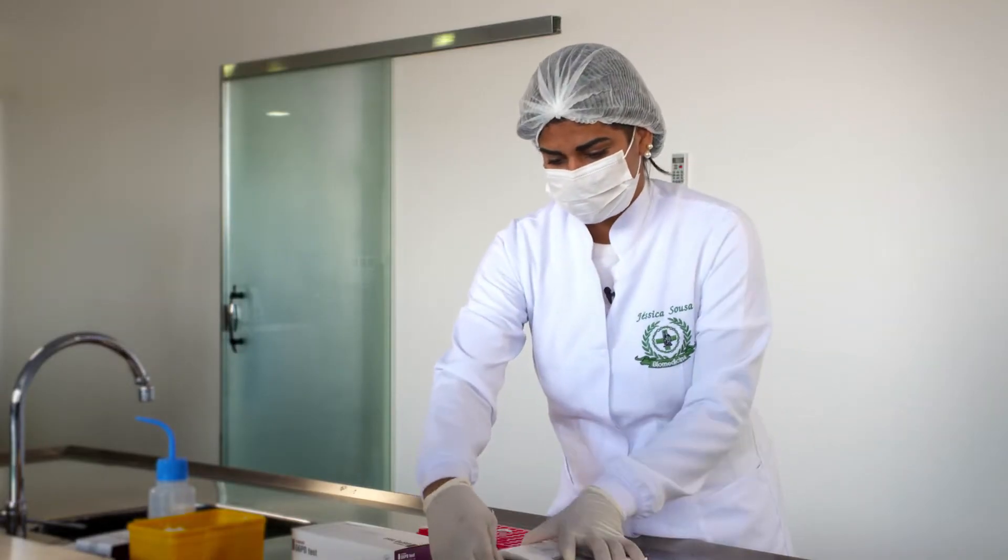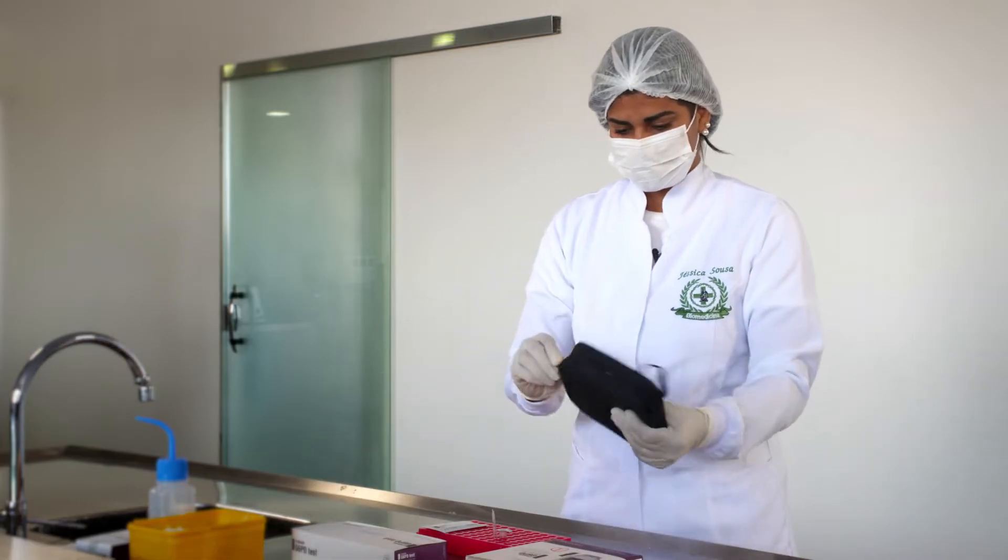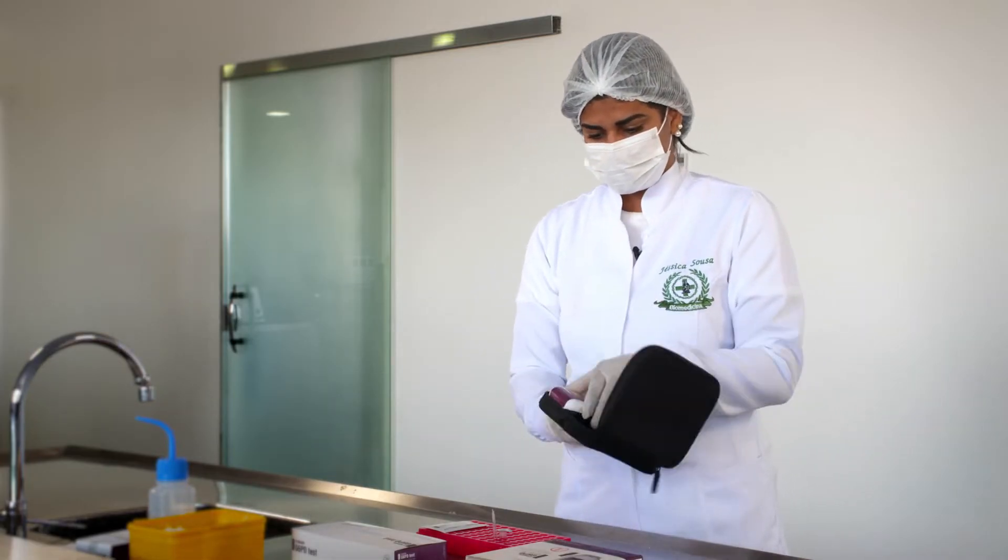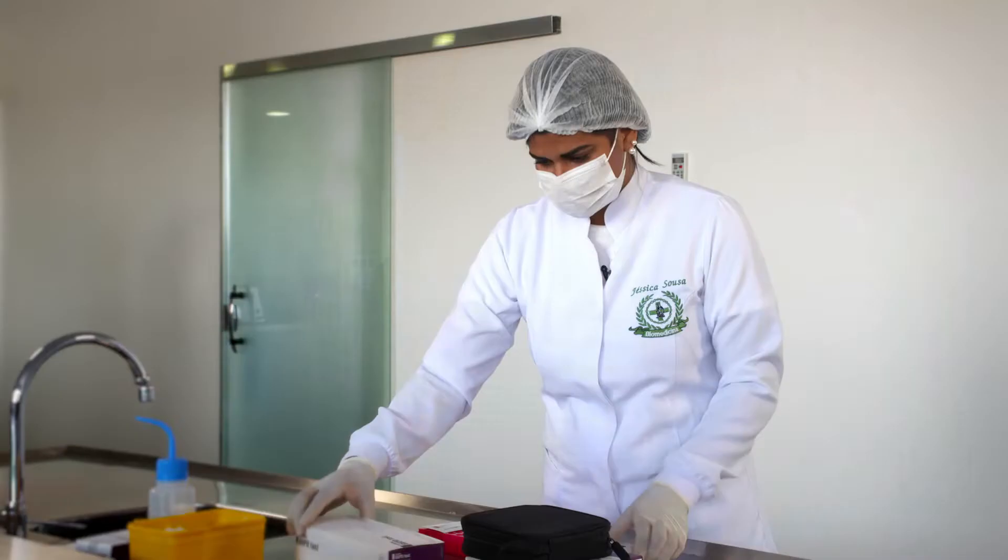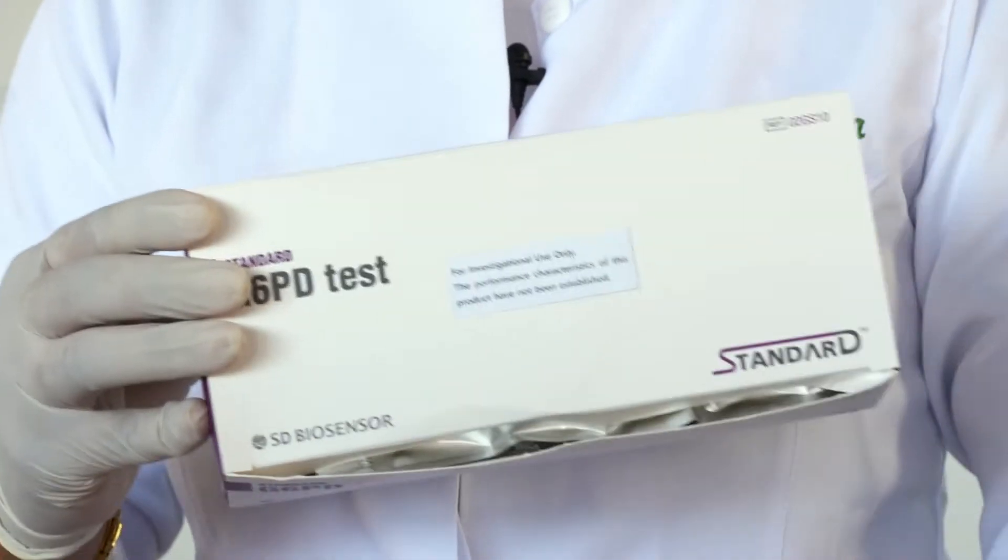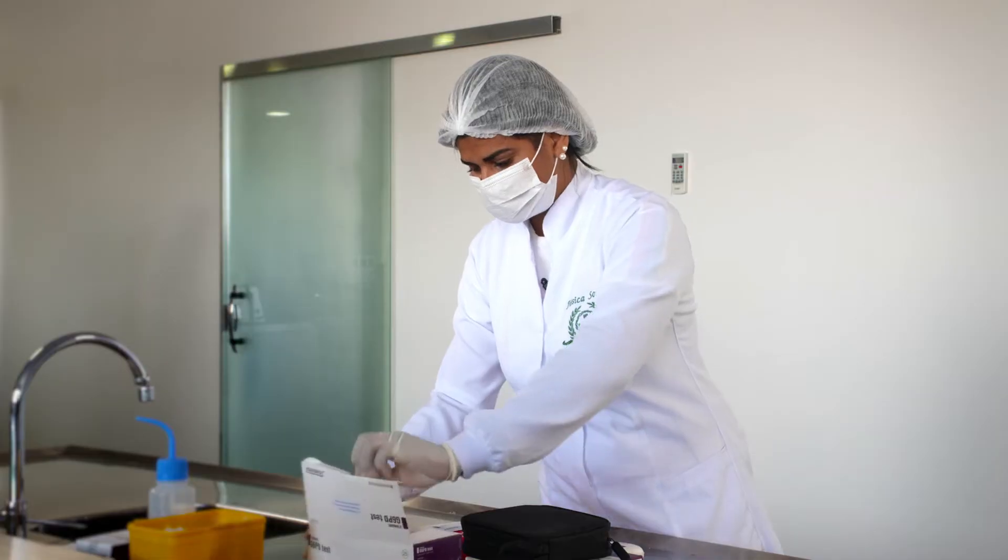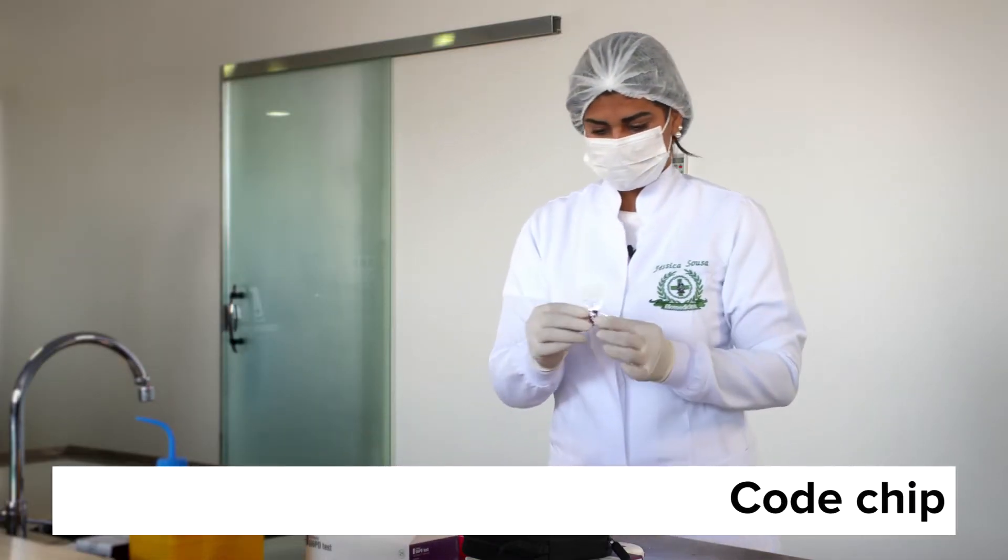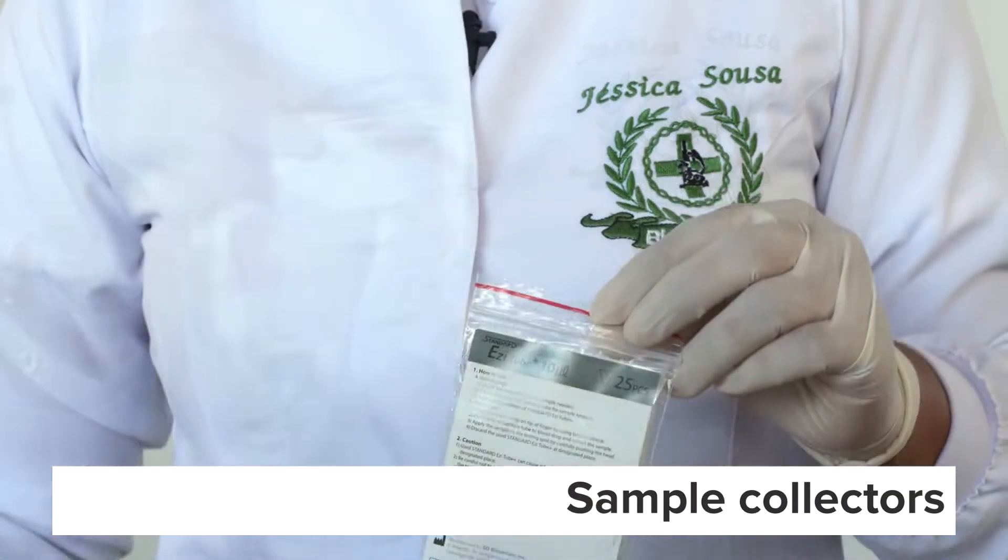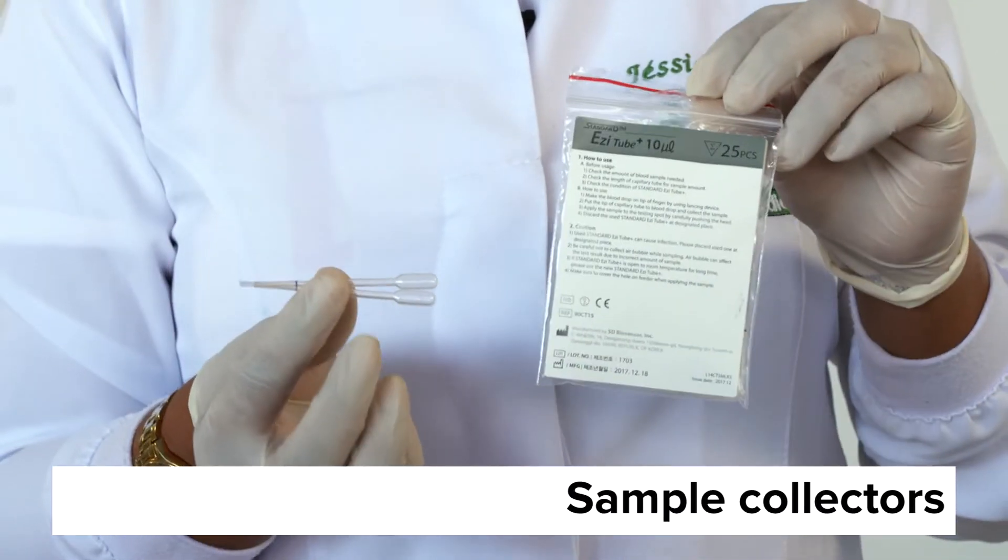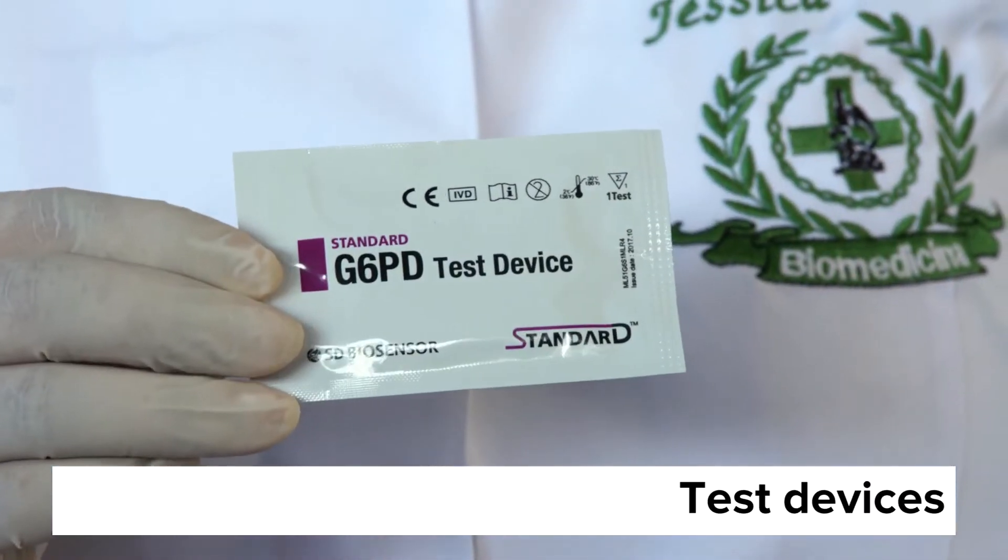The quantitative G6PD test comes with the following equipment: the analyzer and, in a separate box, a code chip, a pack containing the extraction buffers, and a pack containing the sample collectors and the test devices.